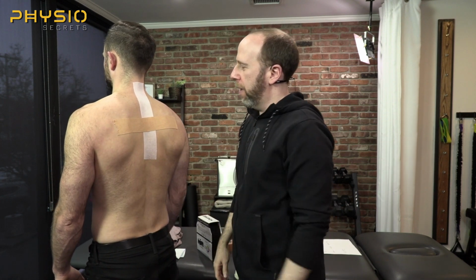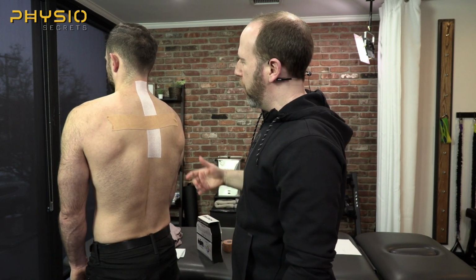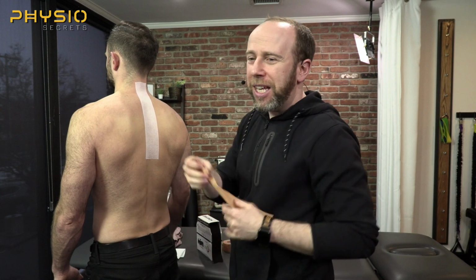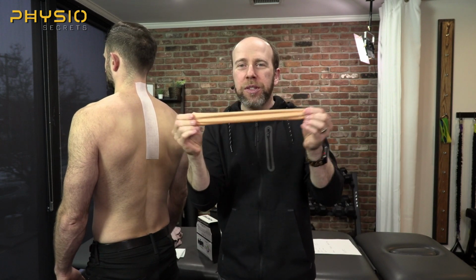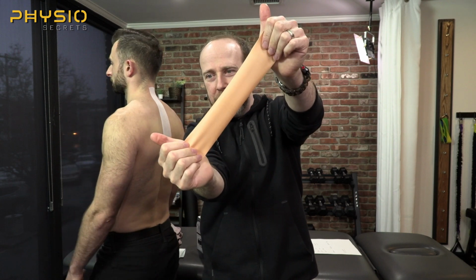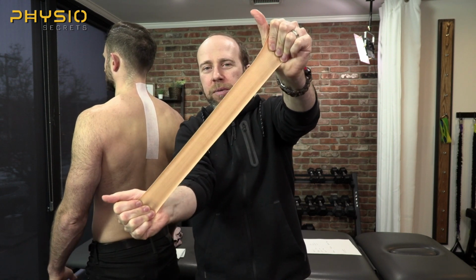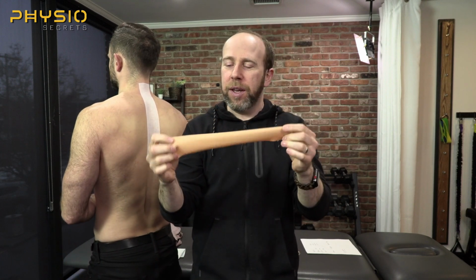And now protract. And you only feel it when? Pretty much like here. Right, so that's not useful. So I have to get the stretch exactly correct with this stuff. Here, now that I have a piece, you'll see how flexible it actually is. So here we go. This is at 0 tension. That's maximal tension. Notice it's only stretching about 2 or 3 inches, right? Very different than the K-tape.